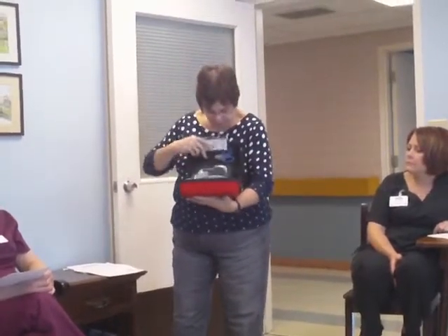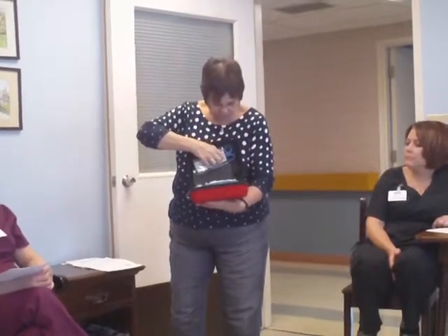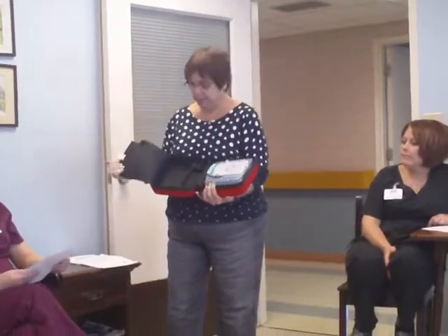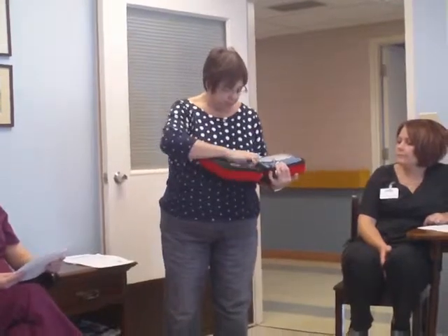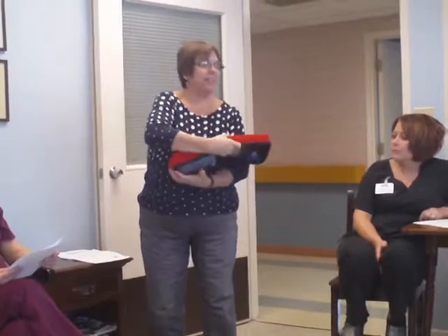If you're not really sure, there's this little cheat sheet in here that shows you where to put things. That hasn't changed, the placements still go where the placements go, so you don't really have to memorize that. There are pictures. There's a little storage thing underneath here, if we decide there's something we can't live without, we can put in here, I suppose. This is Velcroed in. It does come out, but it takes quite a bit to get it out.